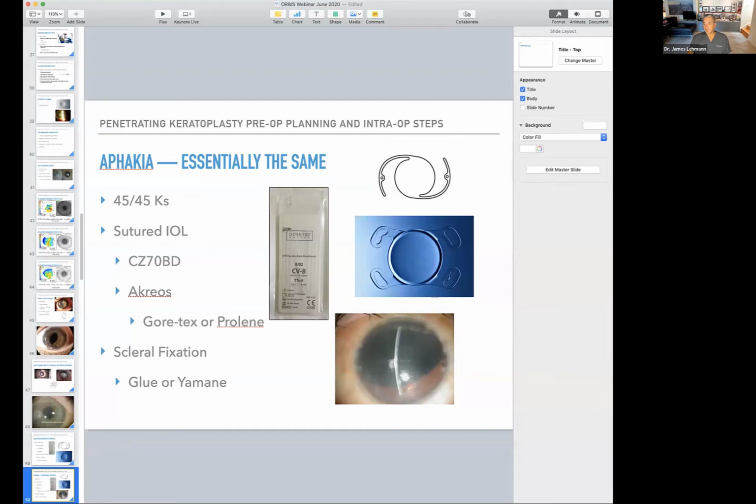Okay, this is from Dr. Manali Hazarika. What precautions should we take while suturing a Flieringa ring? We'll get to that shortly here. And then Dr. Chavi Saini asked, in a patient where we are doing PK before phaco, do we do the measurements for the IOL before the PK? Also, do the incisions change while doing phaco in an eye with PK? Those are very good questions. You do the measurements before the cataract surgery part. You don't do them before the transplant. The incisions do change. You have to be a little more posterior on your incisions and make sure you don't disturb any sutures that are still there.